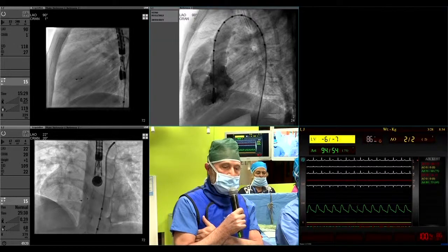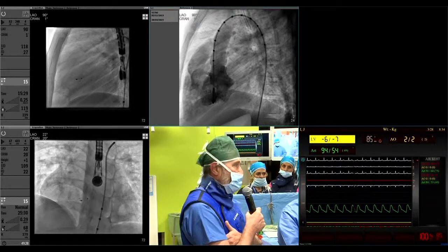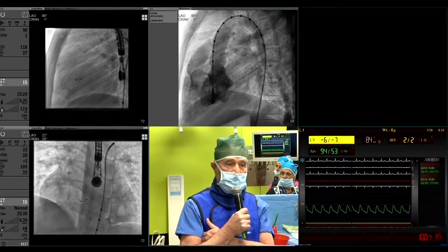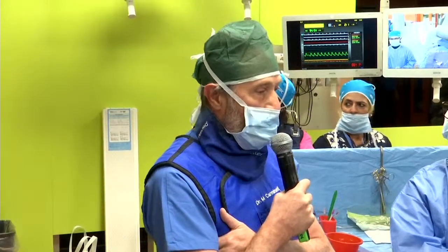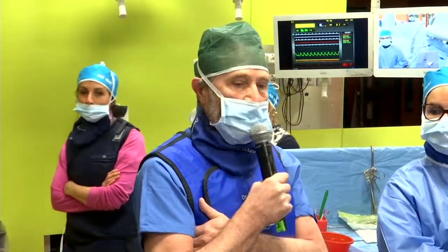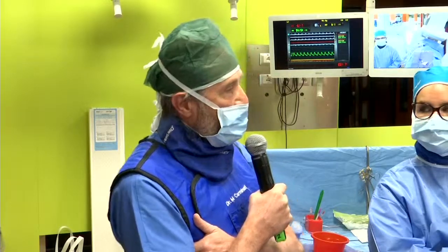Well, the issue of heart block is actually part of the history. It happened many years ago when we were using other devices. As you know, the so-called membranous VSD occluder from Amplatzer was really designed for perimembranous VSD, and the design was okay, but the device was too stiff, and this was the problem of heart block. But when we started using, for example, ADO1, like in this case that Tin did, we did not experience any heart block at all. Tin, any other comments about that?